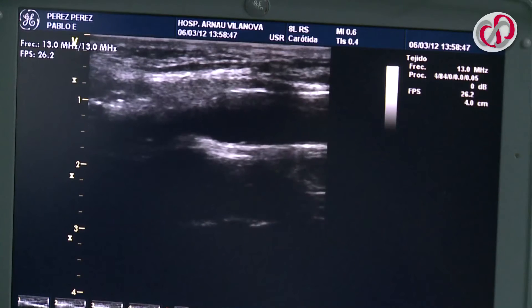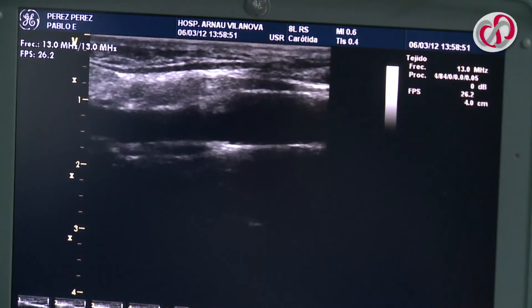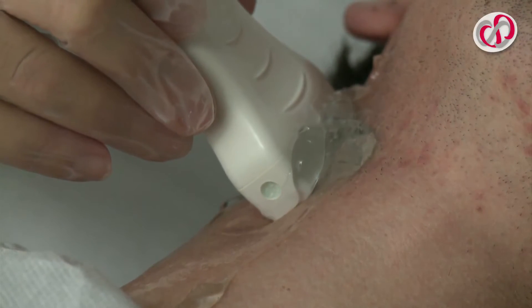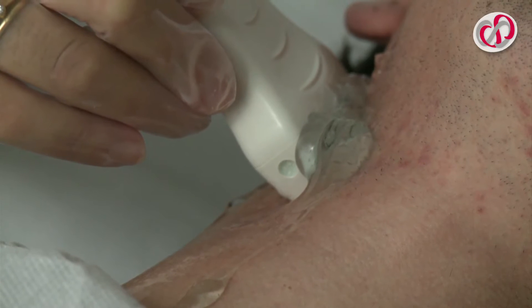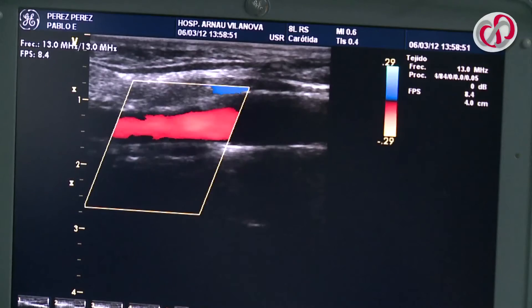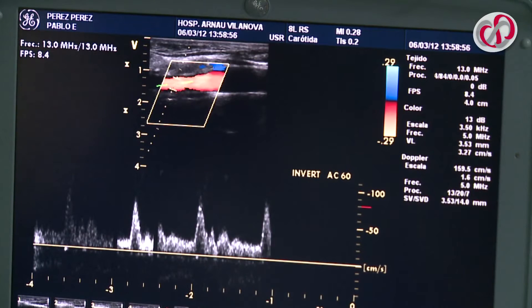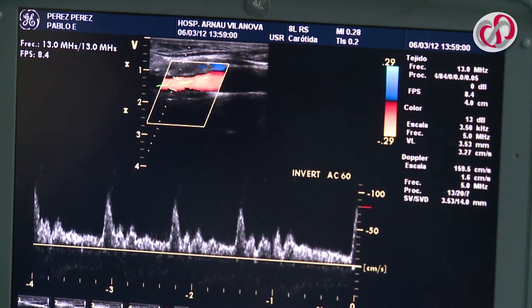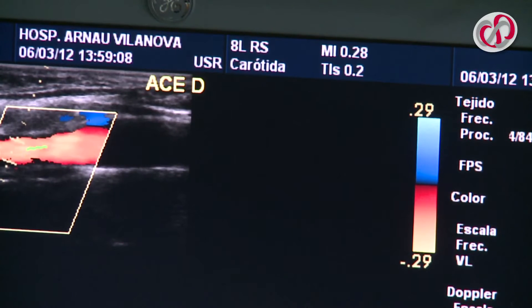To find the intima media thickness of the internal carotid artery, it must first be located. We make a cross-sectional exploration of the carotid as far as the bifurcation, then rotate the probe longitudinally at the level of the bulb and take note of the peaks from the Doppler recording to differentiate the external carotid from the internal carotid artery. Both segments are identified and saved.